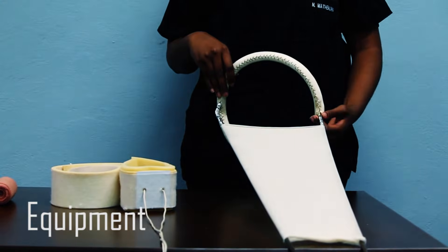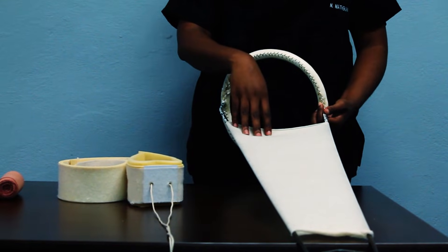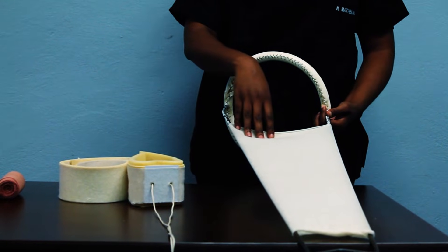Here we have a Thomas splint covered with a stocking net to support the leg. Alternate measures can be used if unavailable, such as a bandage or a pillowcase.